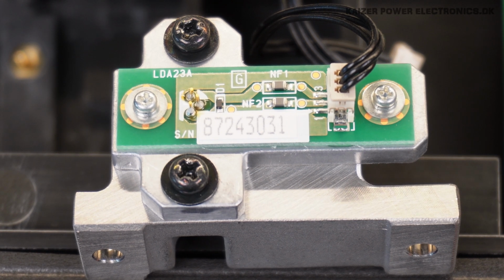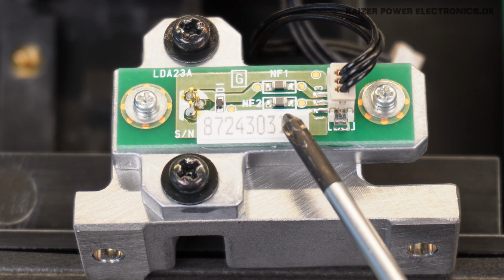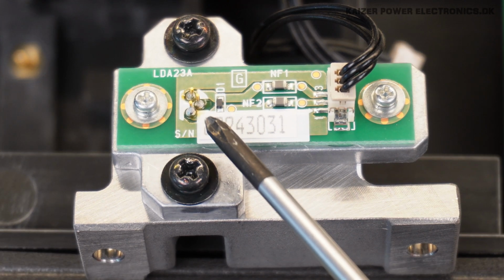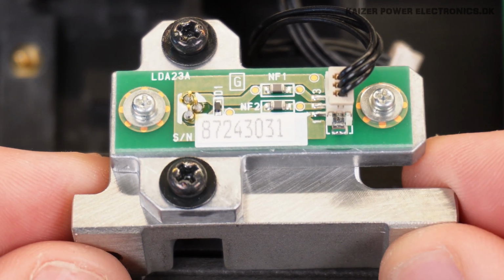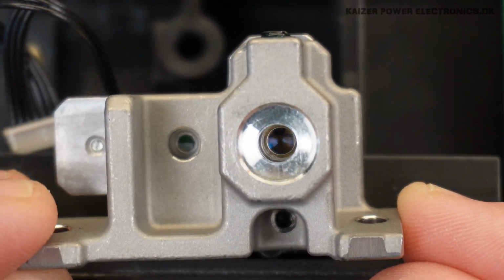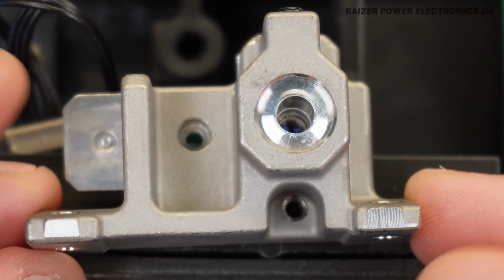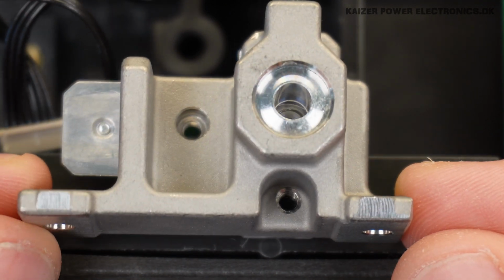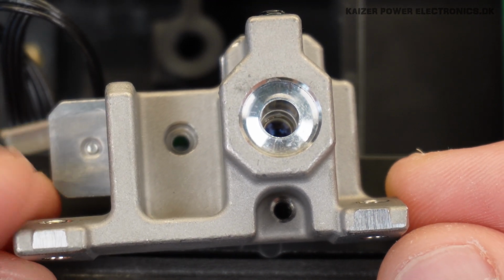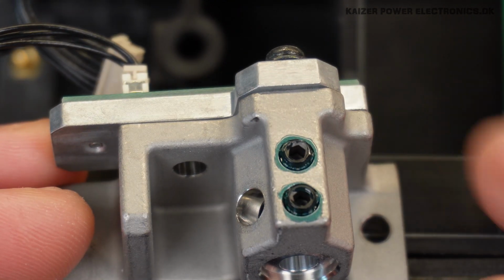The laser diode assembly is quite simple. It is just three wires, going through what seems to be maybe two small inductors for noise suppression. But there we have it, the three legs of the laser diode itself. And it sits in this nice fixture here. So if we turn that around, we can actually see the diode in there. Now, I don't fear that I can't mount this correctly again, because it sits with these nicely polished surfaces up against some supports. So it's really just being held very lightly in place by the two screws. It's all aligned with these set screws that we have here at the top.